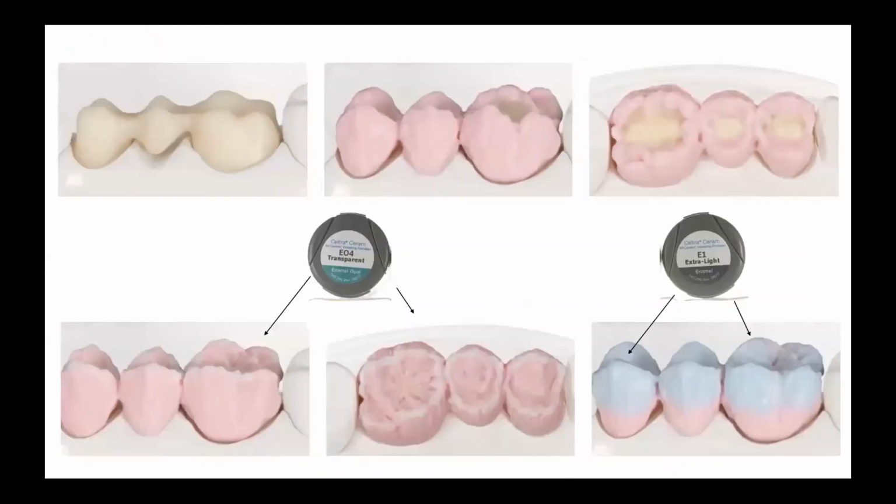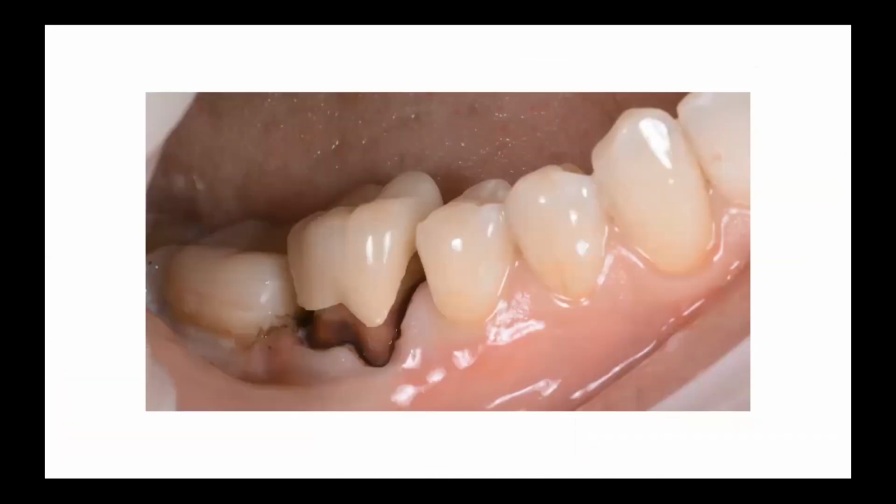And the classic way to make a build up is to choose the dentin of the proper shade, slightly emphasize the transparency of the enamel edge with the help of opalescent transparent material, and after that apply light enamel that has reduced translucency to provide the presence of enamel thread and to provide the distribution of value of our restoration.